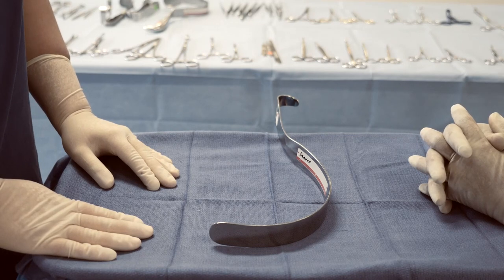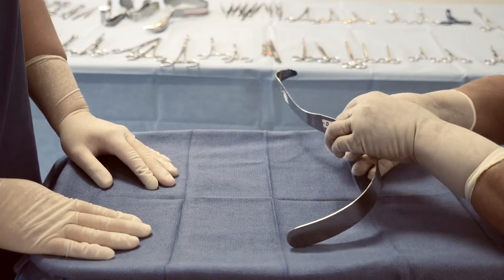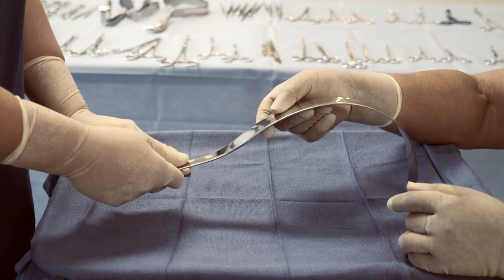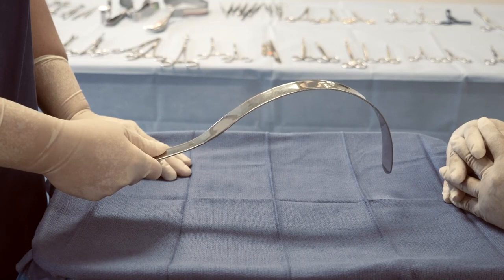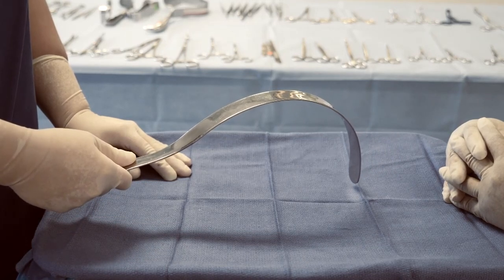To pass the instrument to the surgeon, the scrub nurse will grasp the shaft of the instrument. Aim to place the handle of the instrument in the surgeon's hand. Once it's been passed, the surgeon will then use the instrument to retract deeper layers such as the bowel and the abdomen.